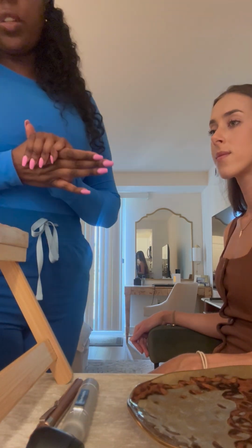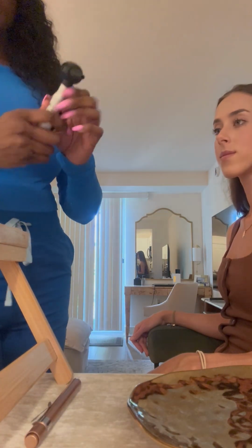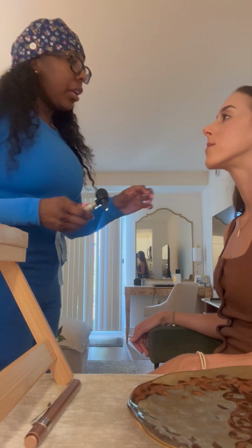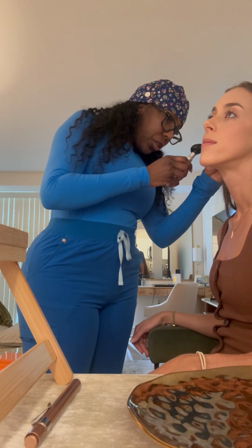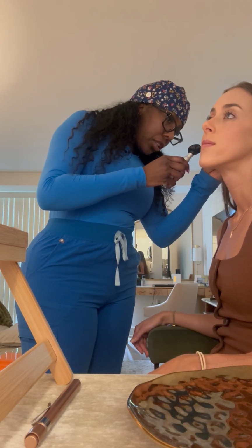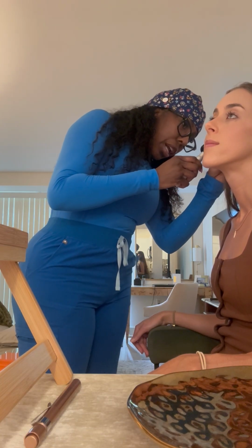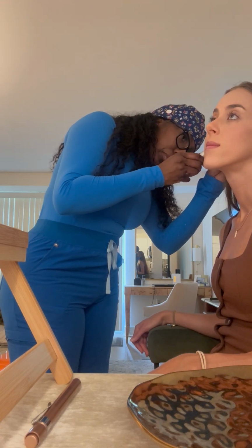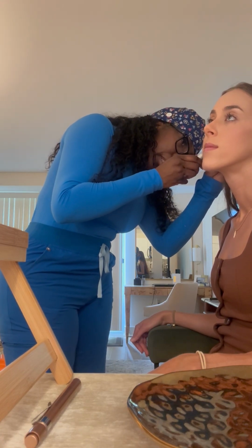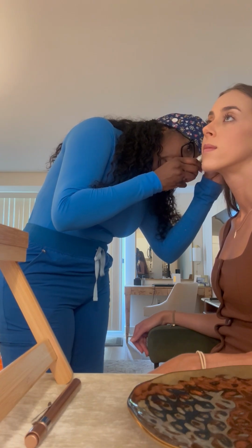Okay, now we are going to move on to hearing. So now I am going to use my otoscope. I'm going to look at the ear for any redness, drainage, or discharge. She's an adult, so we're going to move the ear up and back. Very good. Now we're going to observe the internal ear canal, which is free from any wax. The tympanic membrane appears gray and pearly.